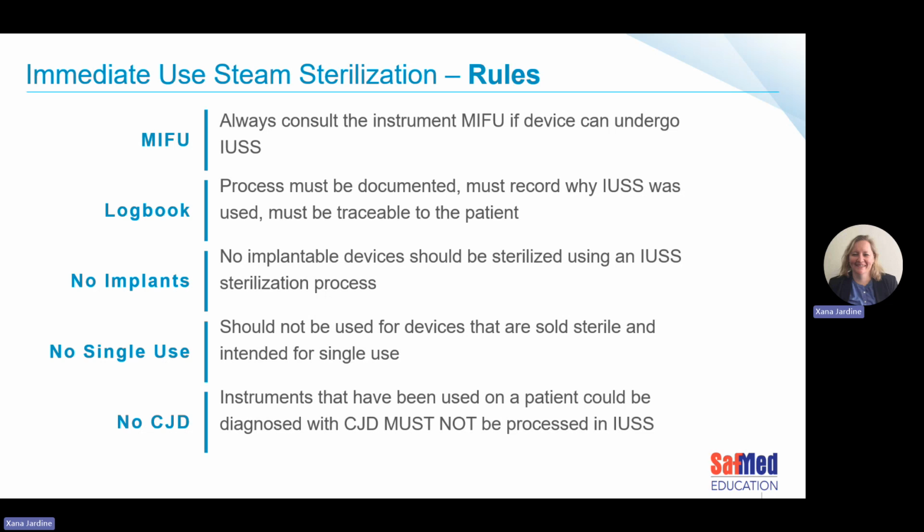Of course, no single-use items, and nothing that potentially was exposed to Creutzfeldt-Jakob disease. So if for any reason there's a chance that your instrument or device was exposed to Creutzfeldt-Jakob disease, you may not reprocess that in immediate use steam sterilization.